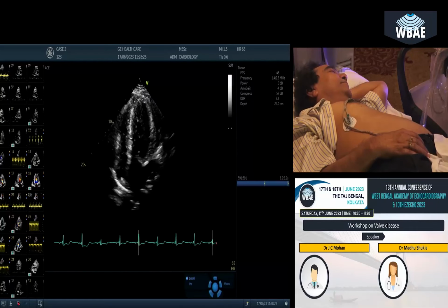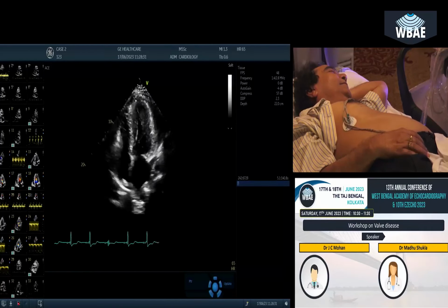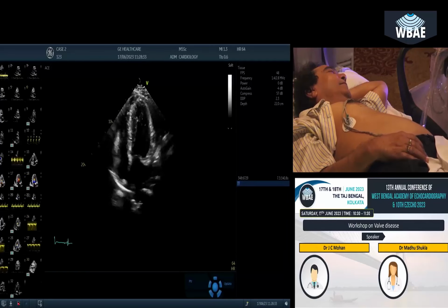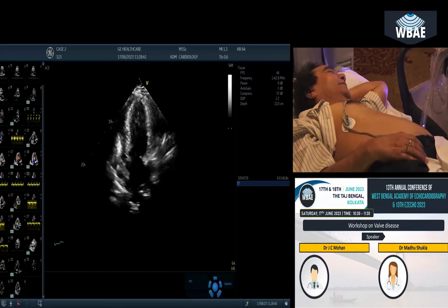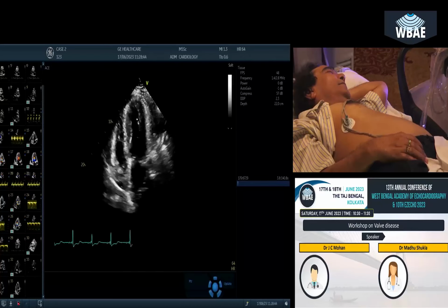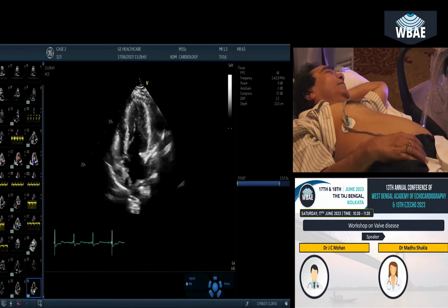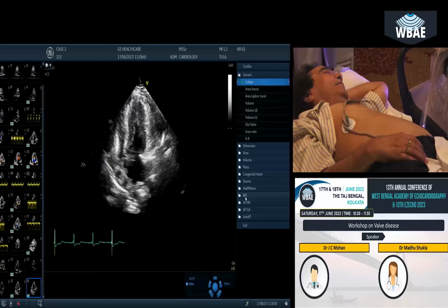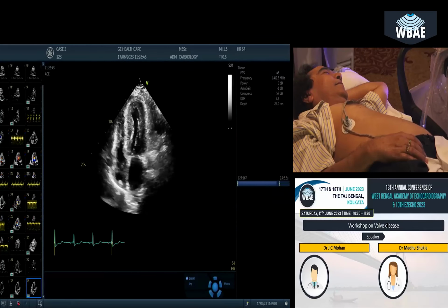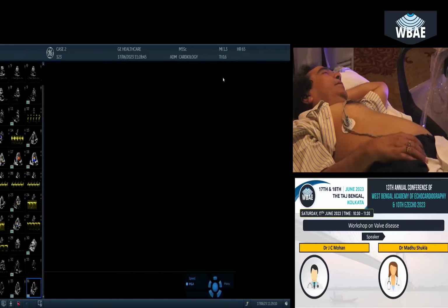Yes, you can see the aneurysm. You can do just GLS here. We will consider that representative of all the three views. We are running a little short of time. That nodularity should bother you. It has some 12-13% sensitivity, but very high specificity. Multiple features are suggestive of cardiac amyloidosis. Prevalence-wise, hypertrophic cardiomyopathy is nearly 100 times more prevalent, so statistically it could be hypertrophic cardiomyopathy, but I will definitely do both a PYP scan and a light chain protein analysis.